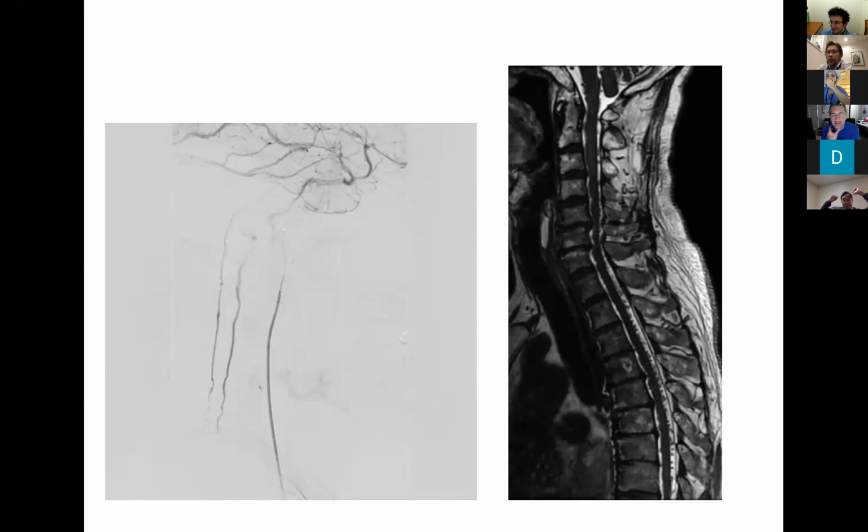Tibor here. Hey, thanks for showing. Okay, hi Tibor. This is super important, especially for younger colleagues, but for me too, as a reminder. When you embark on a spinal angiogram in a case like this, if you did the spinal angio and you find nothing, then you have to go higher, and keep going.